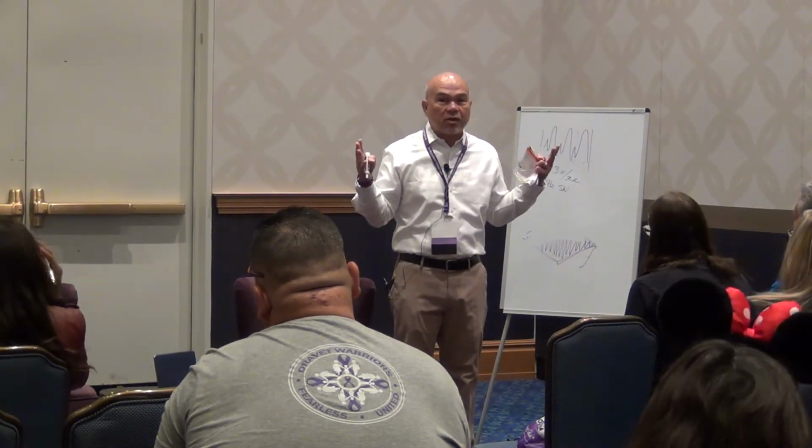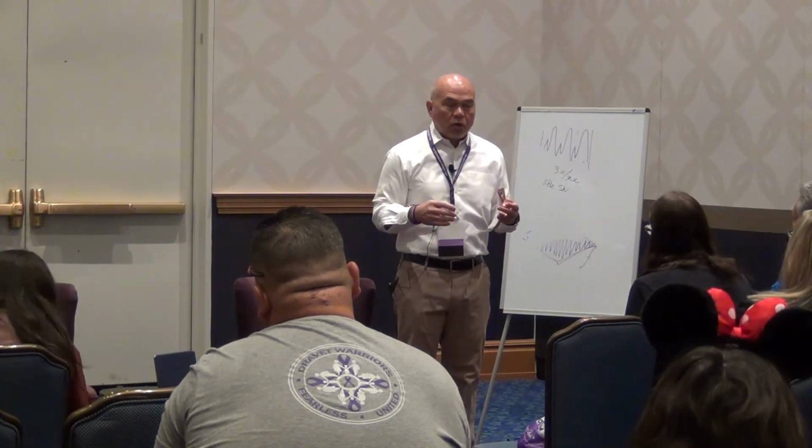What typically happens during an EEG is we ask the patients to hyperventilate, right? You could time how sensitive they are to hyperventilation. Some people don't get to 1 minute. 20 seconds, that's all it takes. And then they start like nothing happened.